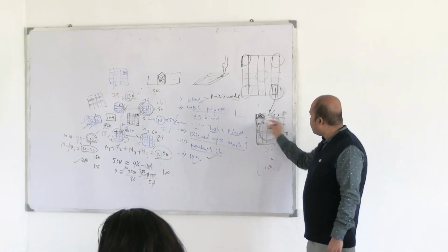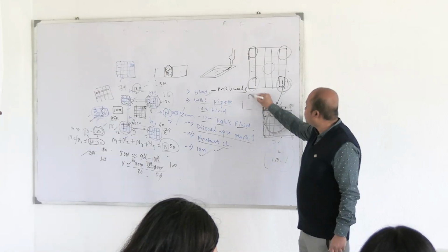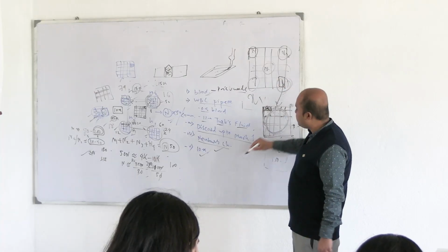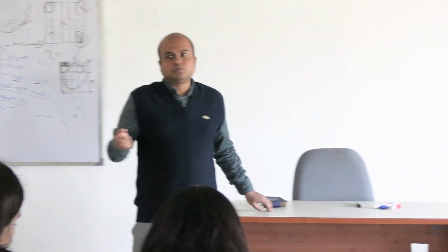So this is counted like this. After this is complete, you write the value, say like this: small x1 for the left upper square, x2 for the left lower square, x3, x4, x5, and capital X is x1 plus x2 plus x3 plus x4 plus x5. Finally, 1 milli. So now what is the calculation?